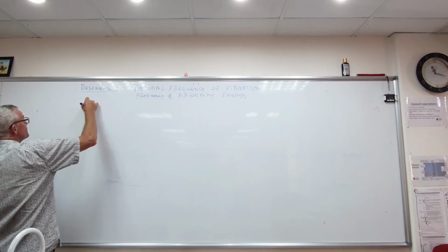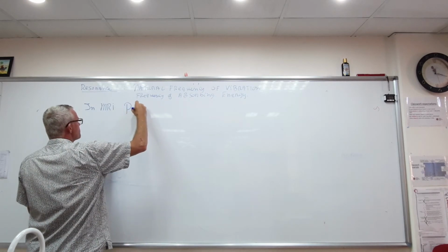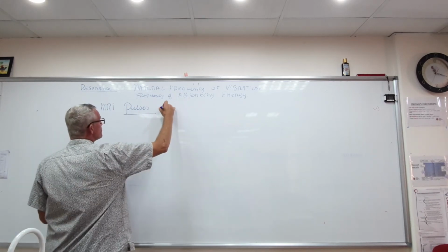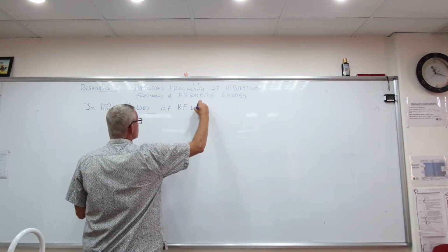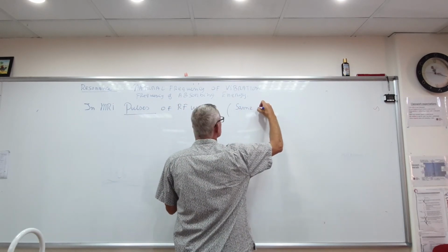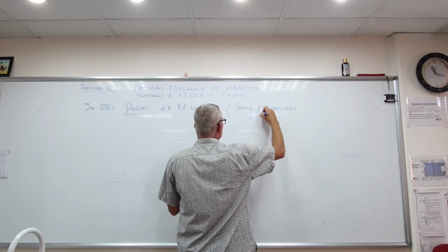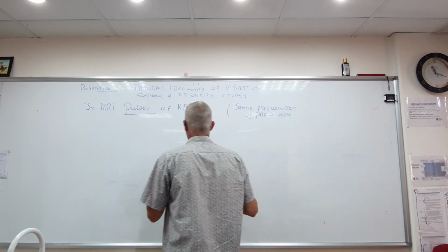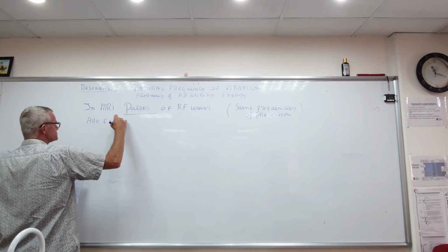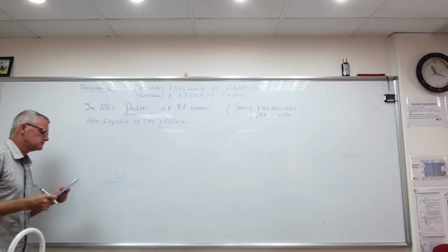So important to know that in MRI, pulses, and I put an emphasis on pulses, yeah, pulses of RF waves, radio frequencies, yeah, and these are the same frequencies of precession, yeah, and these frequencies are exposed to the proton.